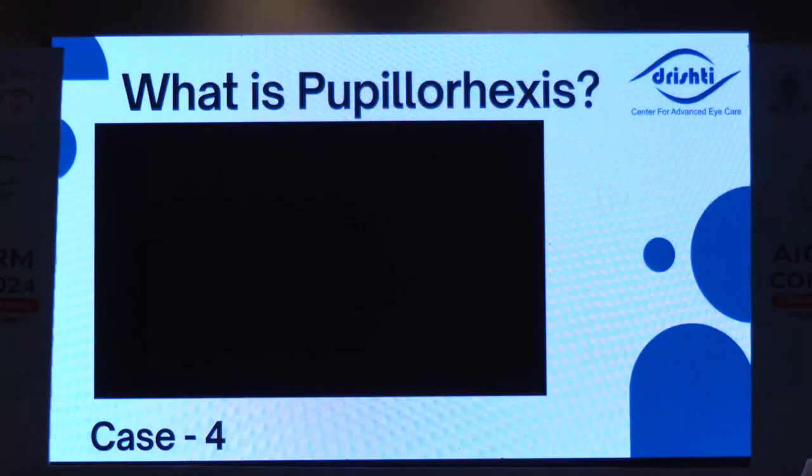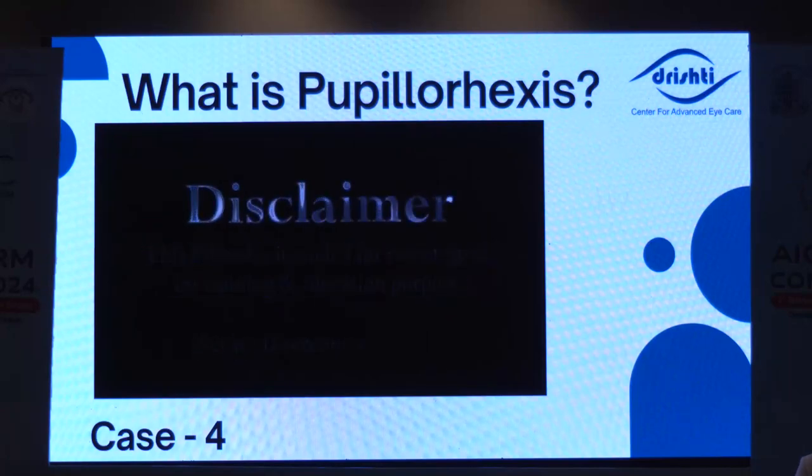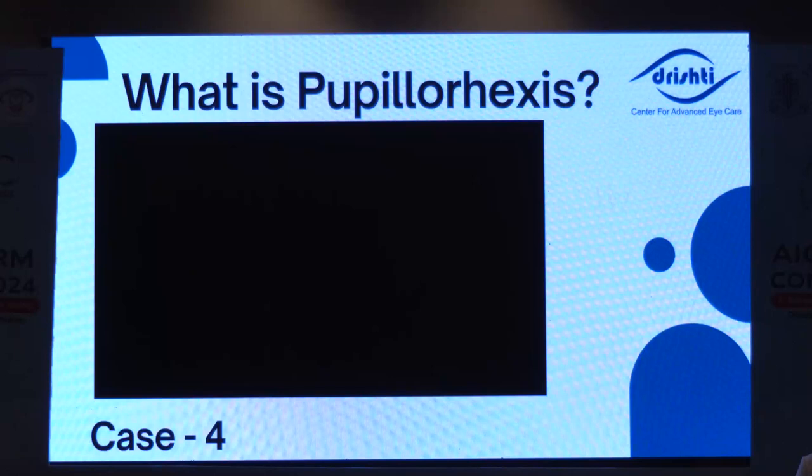Now, this is the last case. This was a young male who had undergone VR surgery for RD, then he went on for SOR, but there was some oil remaining in the anterior chamber.